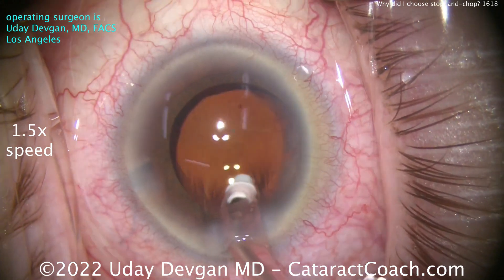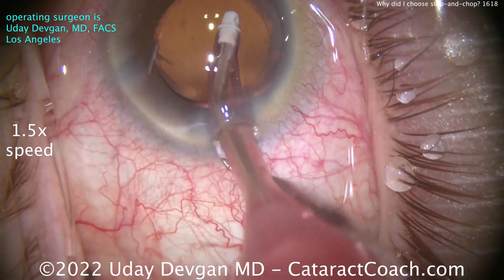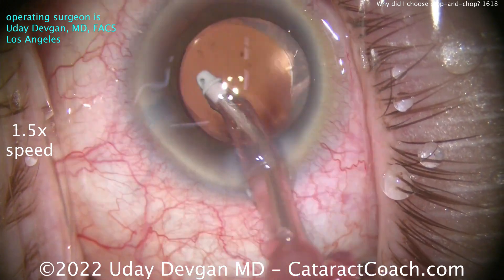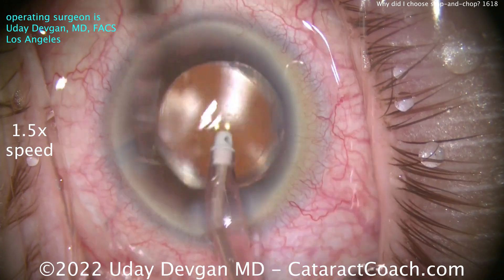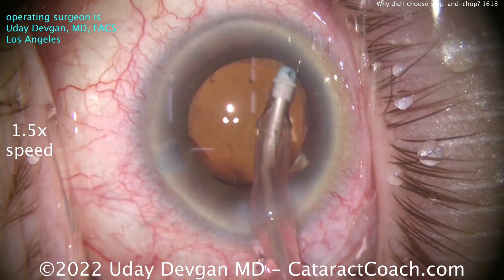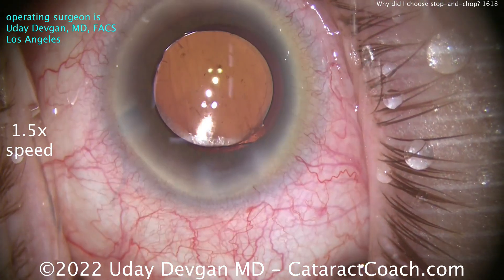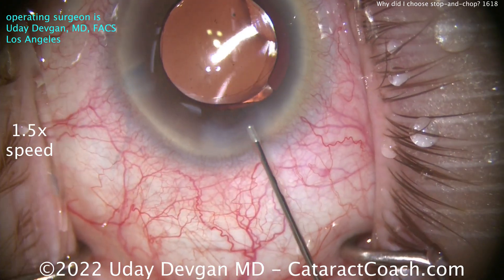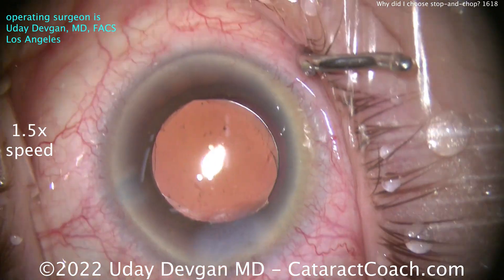Bottom line, take-home message: you may find that divide and conquer is your fastball — what you like for every case. But I still think you should learn how to do stop-and-chop and various combinations of phaco chop, whether it's combo-chop, vertical-chop, horizontal-chop, pre-chop, or even using the femtosecond laser to split the nucleus into pieces. Learn all the techniques, decide which is your favorite, and then for each patient determine what you want to do in that clinical situation.